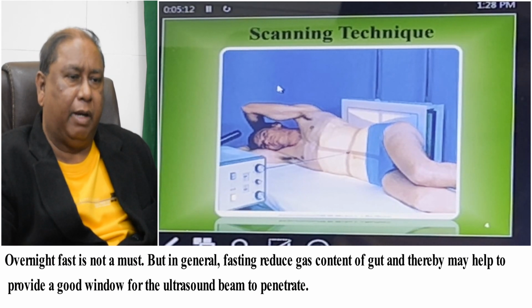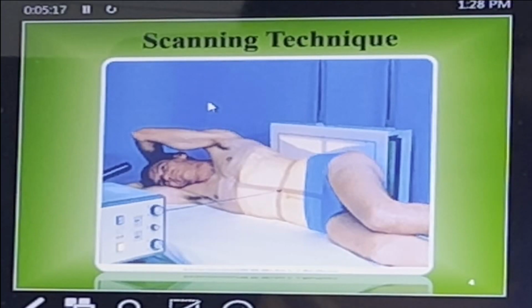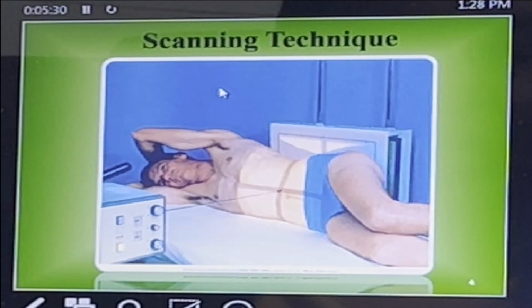Overnight fast is not a must. It is not needed. But if the patient does fasting, there will be less gas in the abdomen. So you can view a clearer picture. And overnight fasting will provide a good window for the ultrasound beam to penetrate. If there is air in the stomach, then spleen cannot be visualized in supine position.